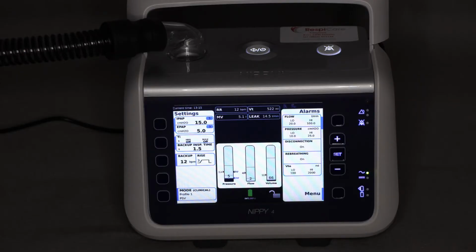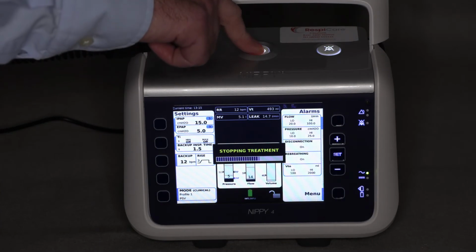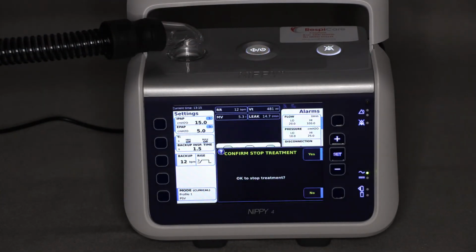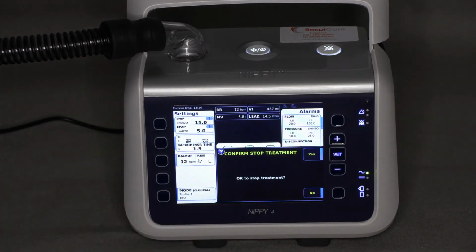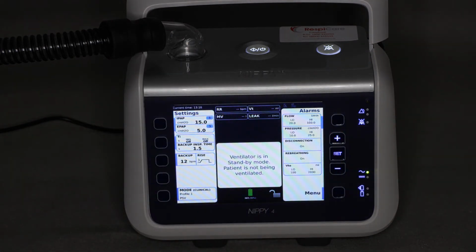In the morning time, or whenever you want to stop therapy, to turn off Nippy 4, simply press and hold the power button again until the progress bar goes all the way from left to right. Nippy 4 will then ask you to confirm that you want to stop treatment, and you'll notice on the screen the words yes and no will appear. Press the button beside the word yes and therapy will stop. The mask can now be removed if you haven't already removed it.